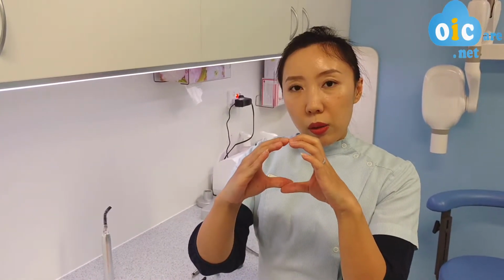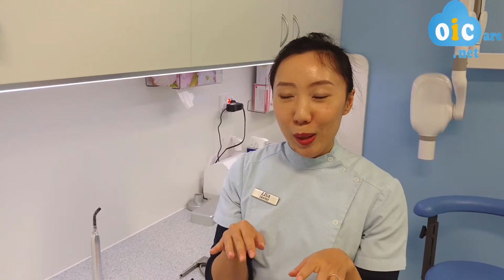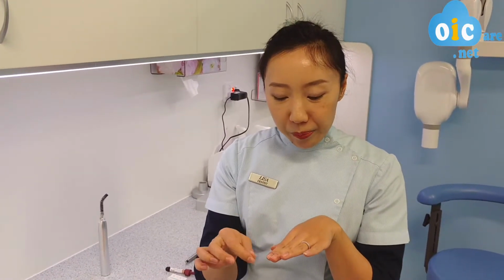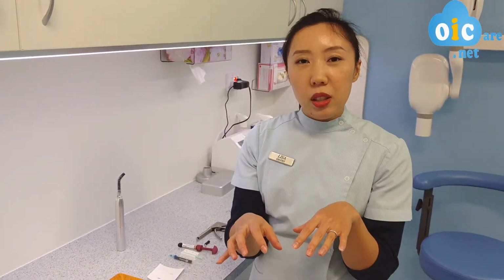The reason we do this is because composite resin has about a 3% shrinkage when it is light cured. If we put in a whole bulk in one go, you get a lot of shrinkage, and because it sticks onto your tooth structure, it can put a lot of internal stress on your teeth, and that can also cause cracks. Girls who do gel nails will probably know a little bit more about this, because the light curing properties of gel nails are very similar to composite resin. When they put the gel on your nails and cure it, you can feel that hot tingling sensation, and a lot of that is coming from the shrinkage of the material.